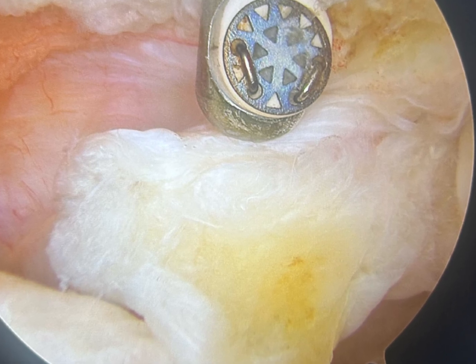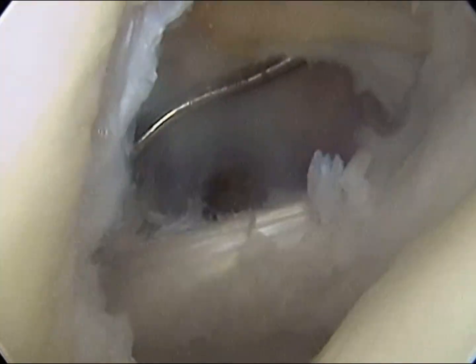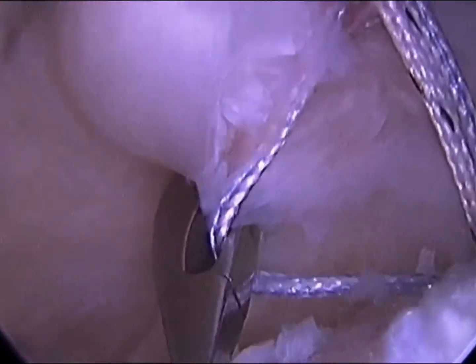So this is the arthroscopic image of the complete subscapularis tendon after release from the surrounding structures. This is the normal arthroscopic image of the subscapularis tendon, and in this case you can see the complete separation of the tendon from the footprint of the lesser tuberosity, and in this I have already passed the suture thread.